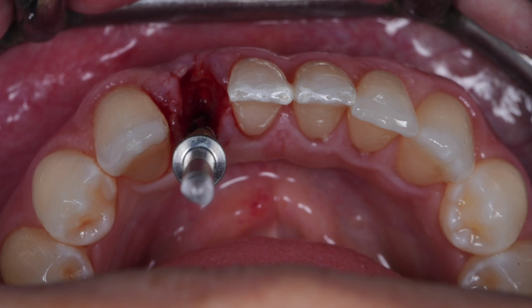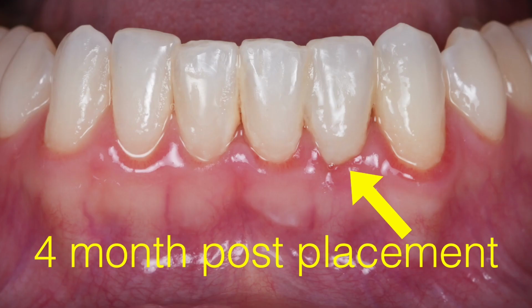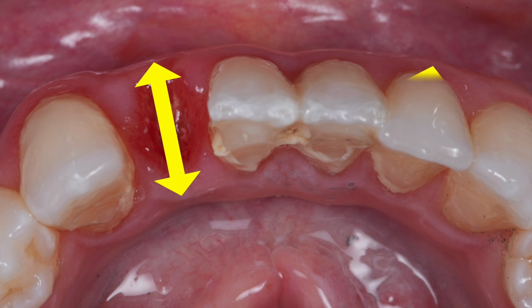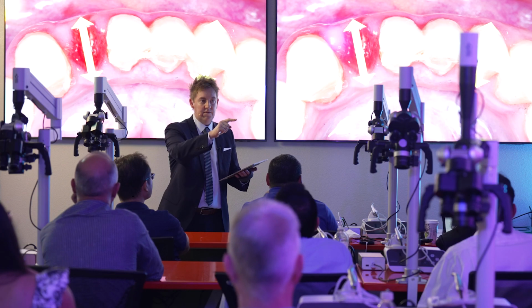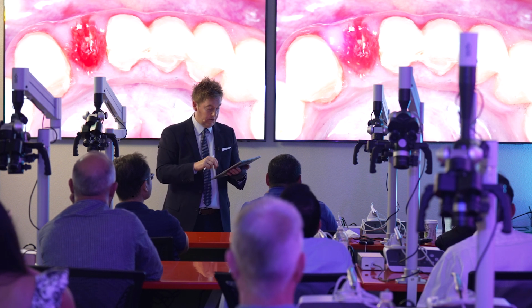And in a lot of cases today, I don't even take the tooth out. I do a partial extraction therapy. Okay? Here it is 4 months post. Then I remove the bar, and I want you to look at her ridge relative to the other side. How much has it resorbed moving from the buccal to the lingual? Not much at all. Things are looking pretty good.